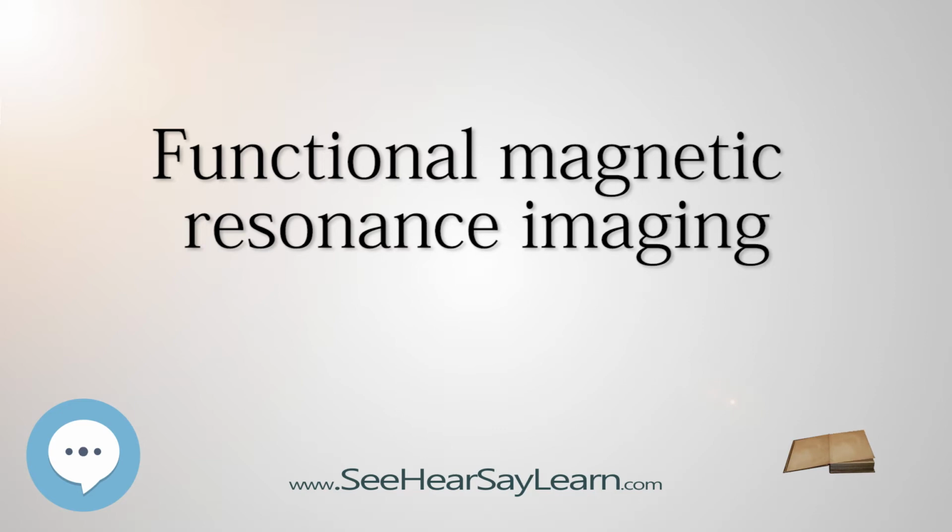Medical use. Physicians use fMRI to assess how risky brain surgery or similar invasive treatment is for a patient and to learn how a normal, diseased, or injured brain is functioning. They map the brain with fMRI to identify regions linked to critical functions such as speaking, moving, sensing, or planning. This is useful to plan for surgery and radiation therapy of the brain.